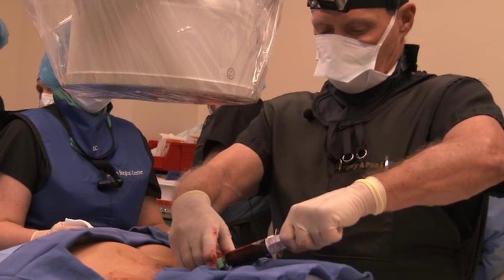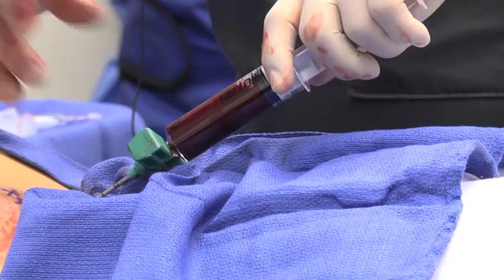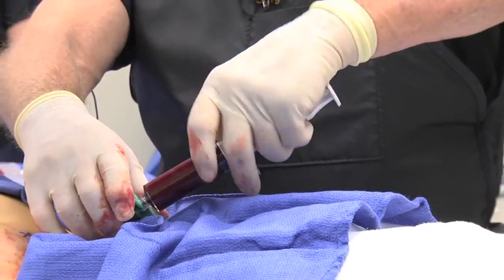We're drawing bone marrow from the iliac crest. We'll remove this needle and then we're going to re-prep and drape the patient.